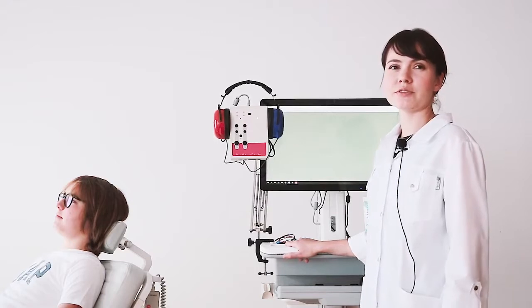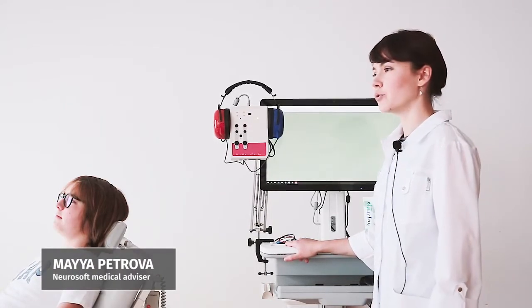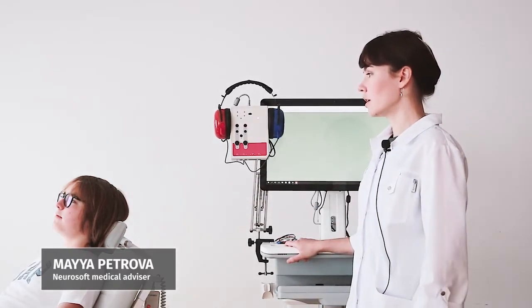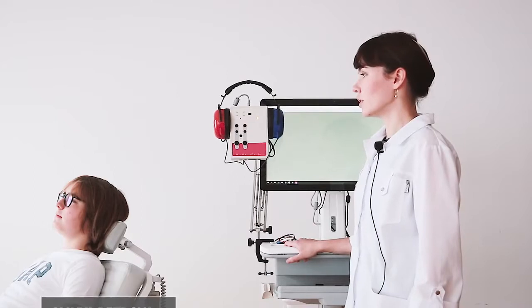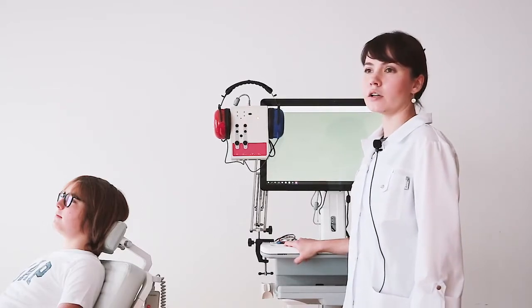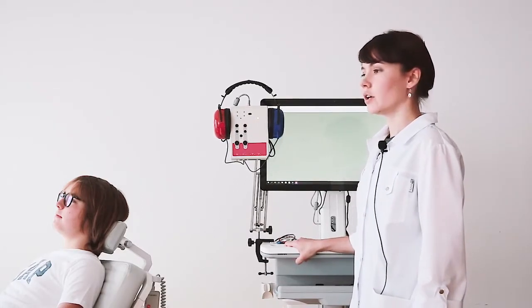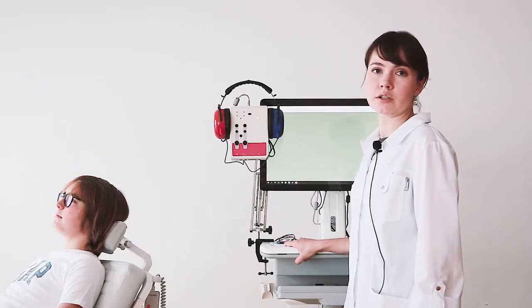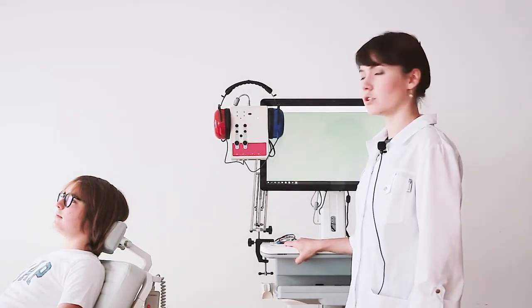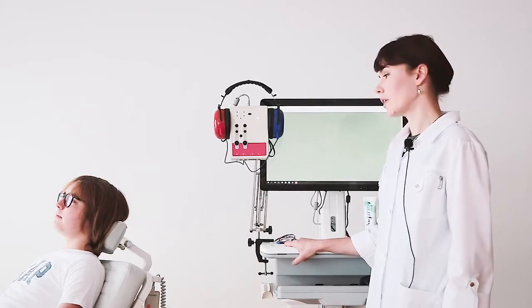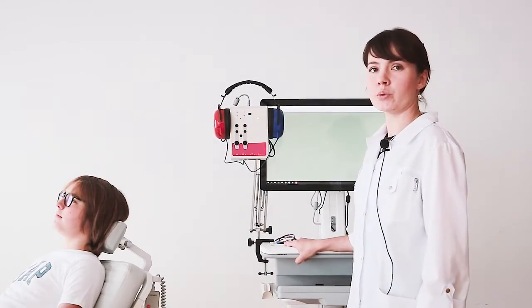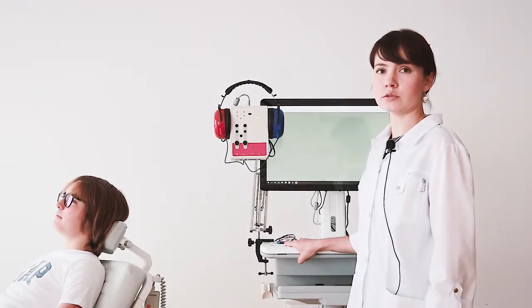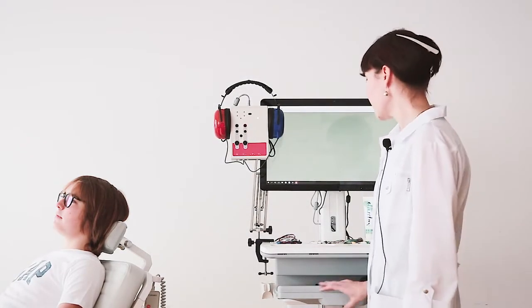Now let's continue with the auditory brain stem responses. Before performing this test, we need to check if our patient is fully relaxed, especially his neck and face muscles. If your patient is a child, it will be better if he or she will sleep during the procedure. And our room must be well sound-proofed and has good grounding for this test.